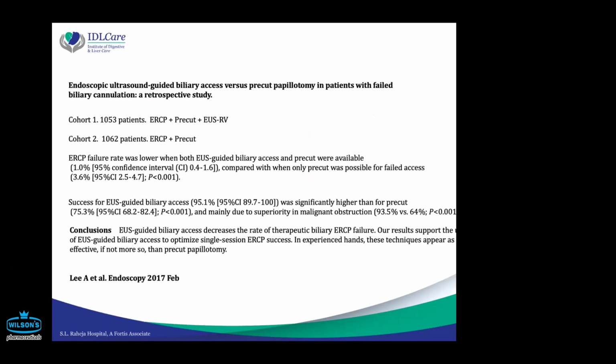So following this, there is another study published in Endoscopy on the same topic, and they have also concluded that EUS guided biliary access decreases the rate of therapeutic biliary ERCP failure. So rendezvous should be utilized to optimize a single session success. So this is another point to remember. If you have difficult cannulations in your unit, rendezvous is a useful procedure.